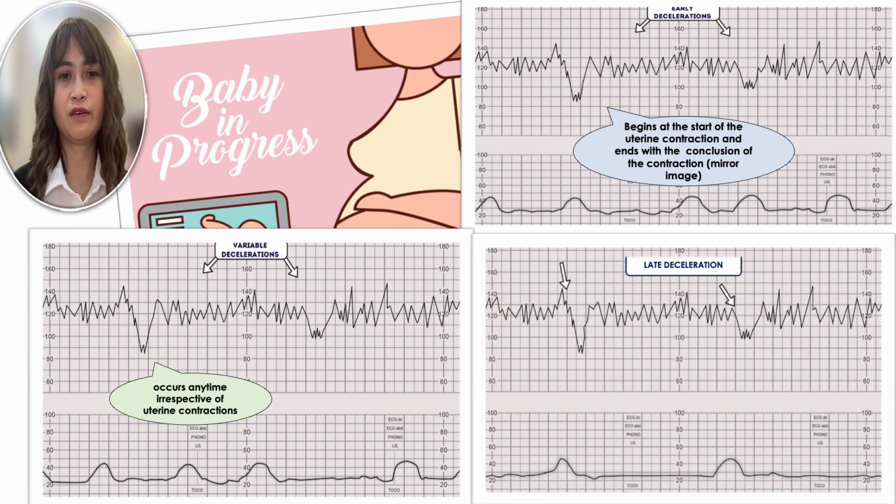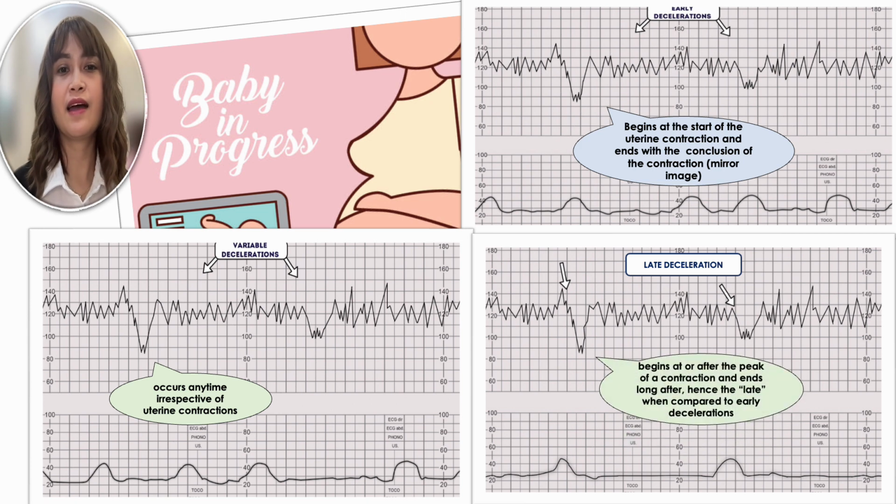Also, late deceleration, which begins at or after the peak of a contraction and ends long after, hence the late when compared to early decelerations. This might be due to fetal hypoxia, a uteroplacental insufficiency, which is the most worrisome deceleration.